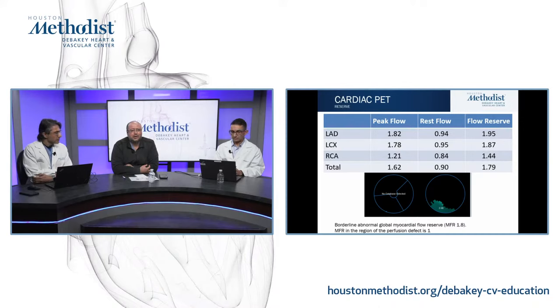And now we have also the added impact of flow, and recently we published a paper on nearly 4,000 patients who had PET and atherosclerosis burden assessment by calcium score, and both values add to each other. So if you look at the information you gain from calcium score, you add more information by adding the flow reserve in these patients from a prognostic standpoint.